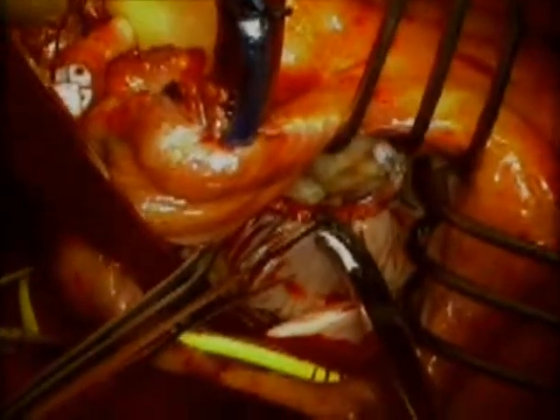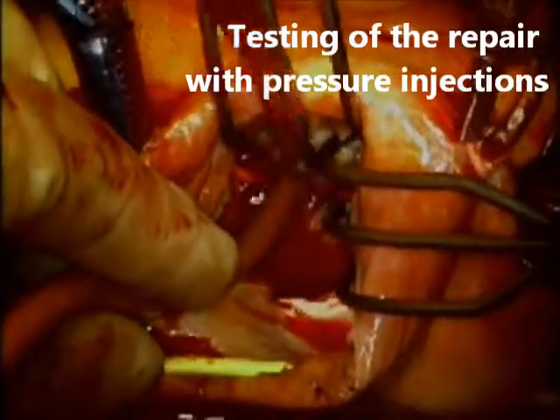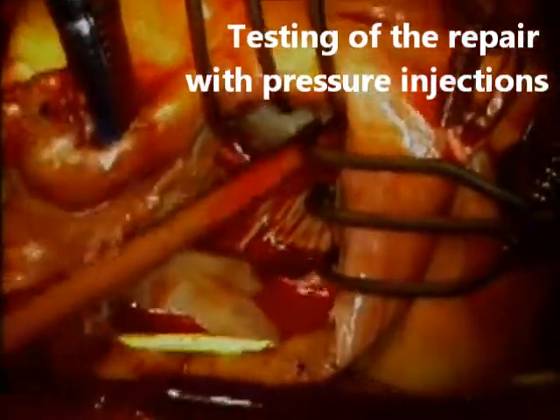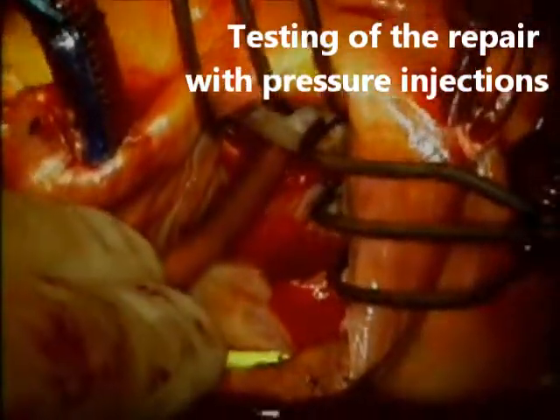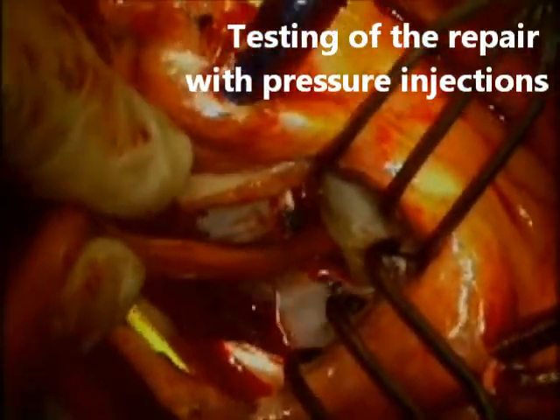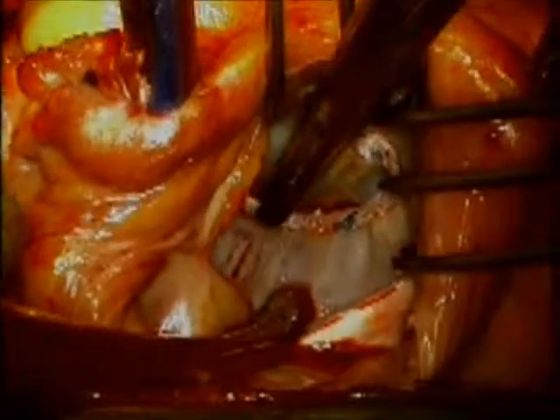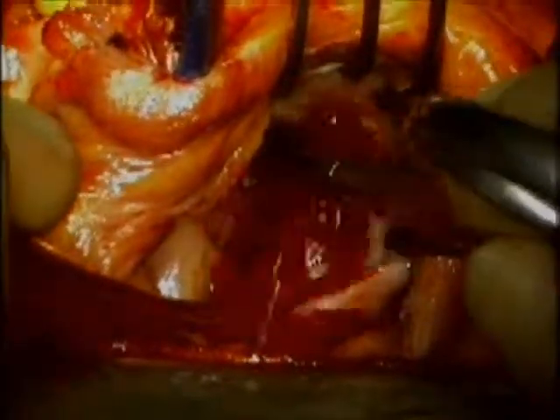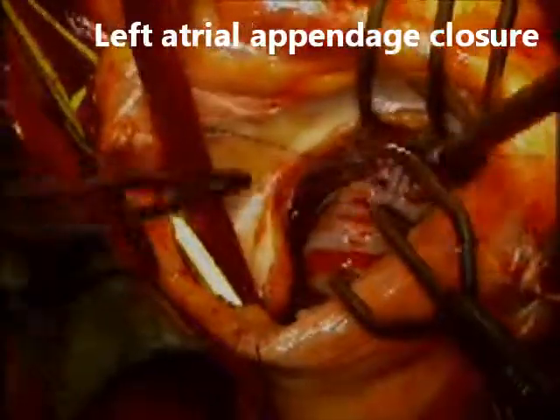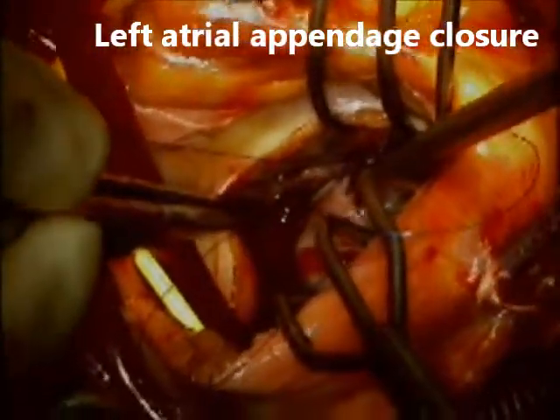To proceed with our moment of truth, I use a red rubber catheter with a bulb syringe and inject saline solution into the ventricle under pressure to see if the mitral valve can hold the pressure with no leak. As you can see, the valve here is perfectly competent, and if I push on the anterior leaflet you can see how the saline squirts out of the ventricle under pressure. This finding gives you good confidence that your repair is of good quality.